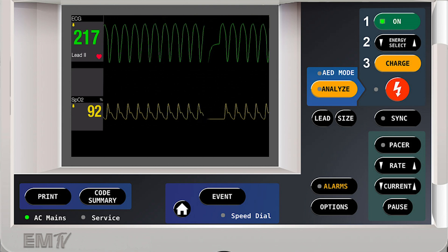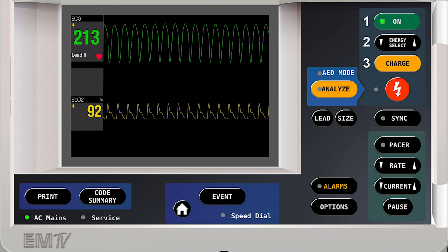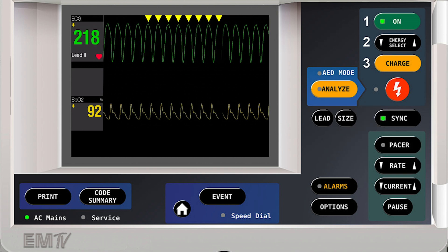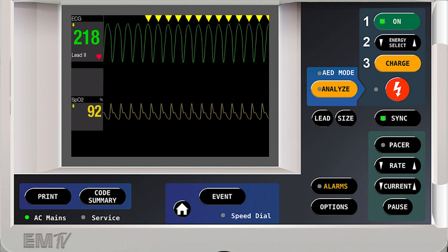As this first shock was not effective, I'll go ahead and hit the sync button again, making sure I can see indicators above all R-waves.